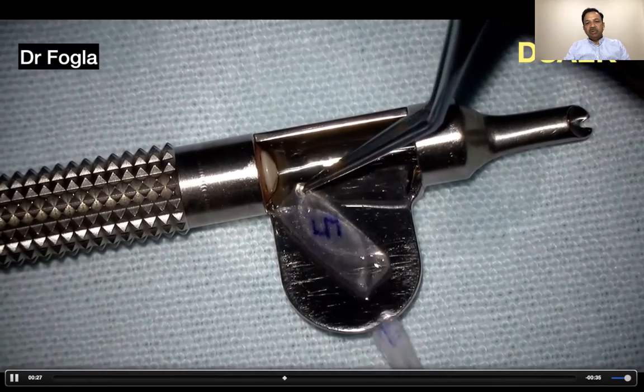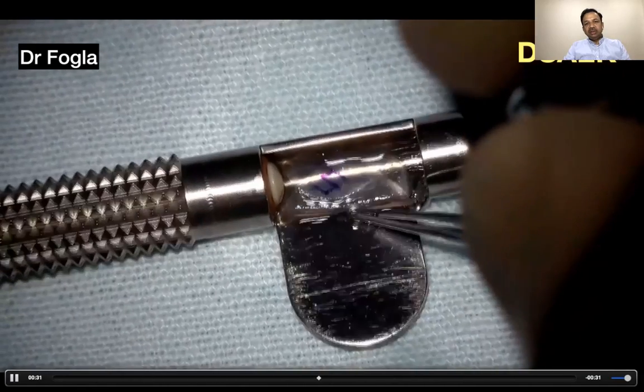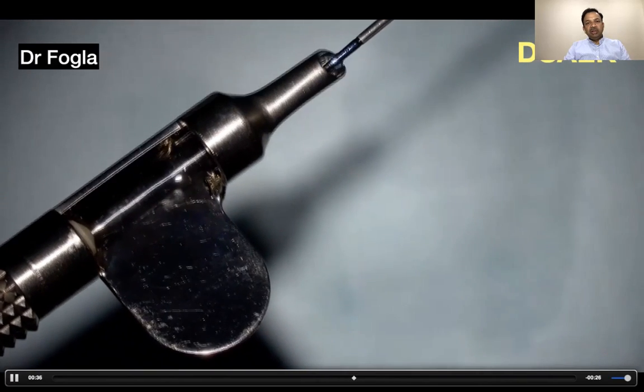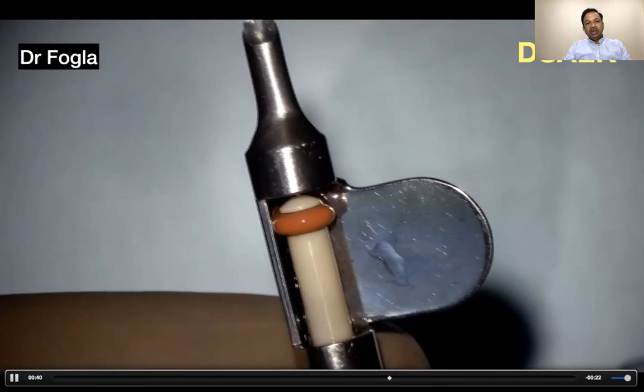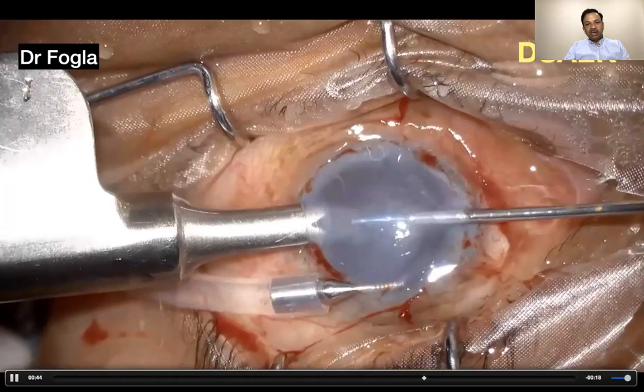There are various types of injectors available. The popular one is the Busin Glide. This is the one which I use. This is from an Italian surgeon, called the Macaluso inserter. You have the Endoglide, you have the Endoserter, and the Endosaver. There are a lot of devices.